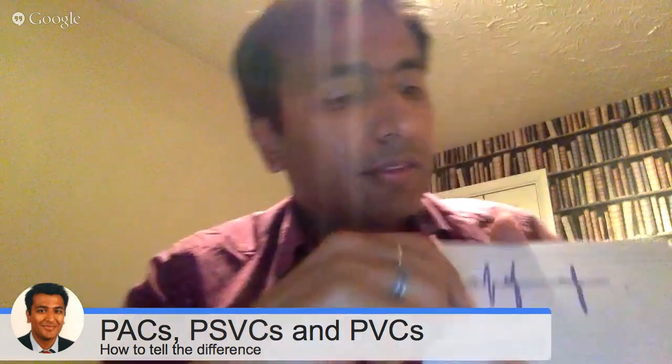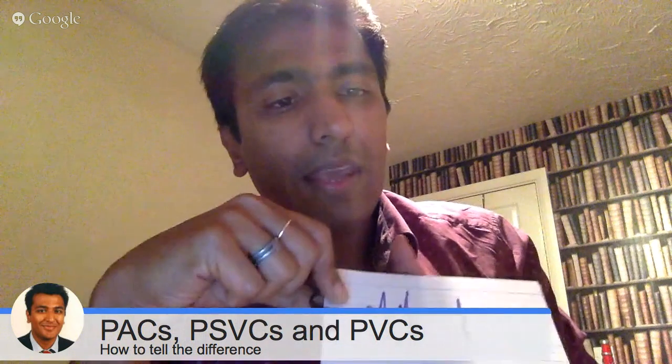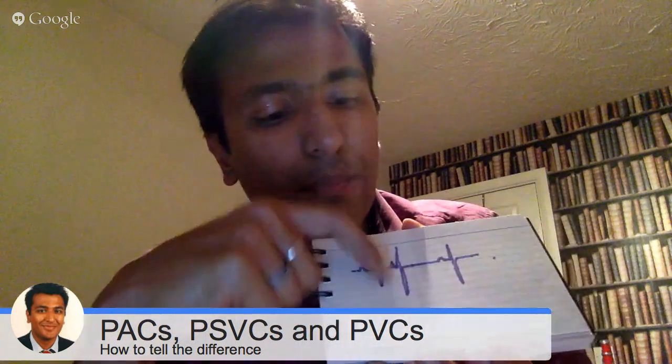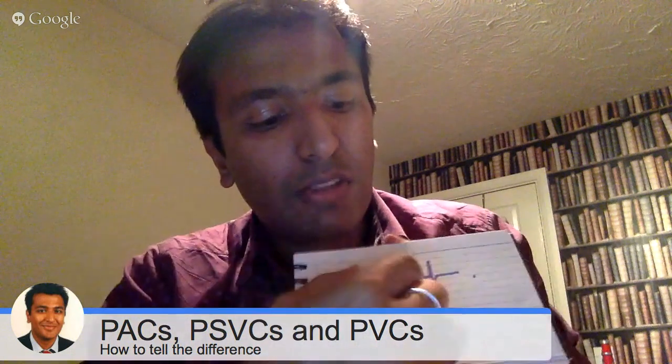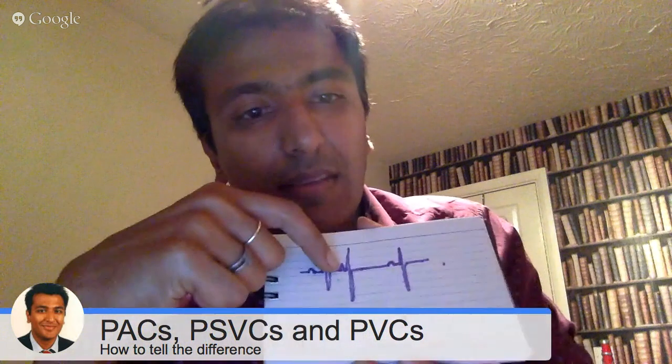Now, the second thing to say is that the lower the impulse arises in the heart, the broader the QRS complex gets, okay? So if your impulse is being released in the atrium, you will still get a P wave, you'll get a premature complex. So instead of waiting that time, you've got a premature complex here, but it's still got a P wave.